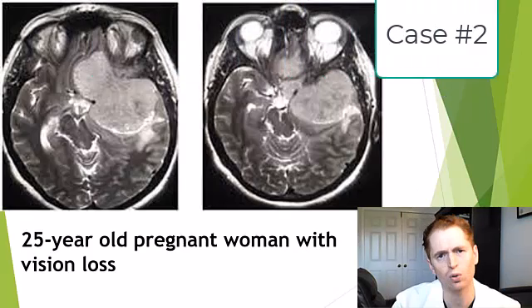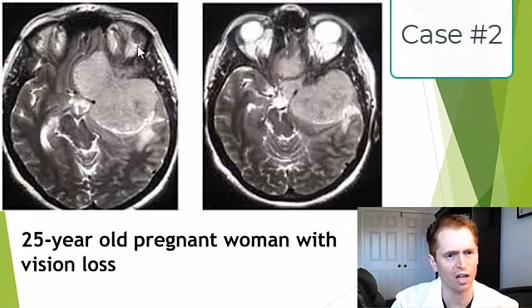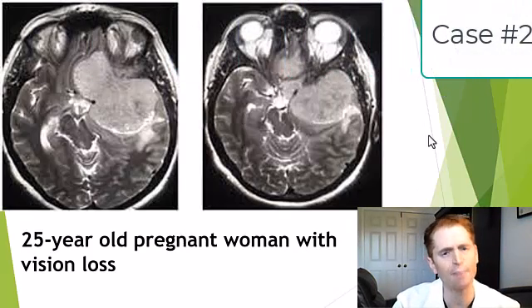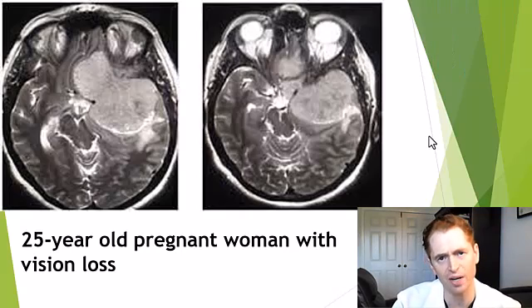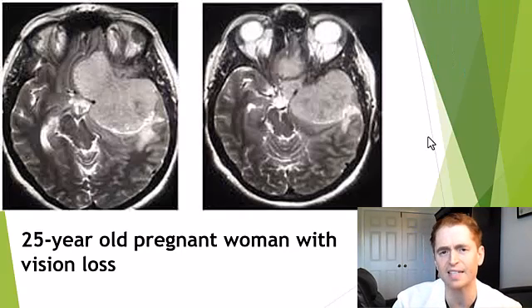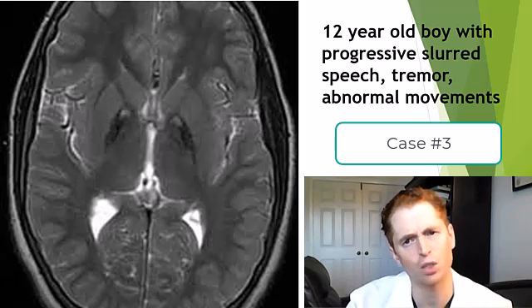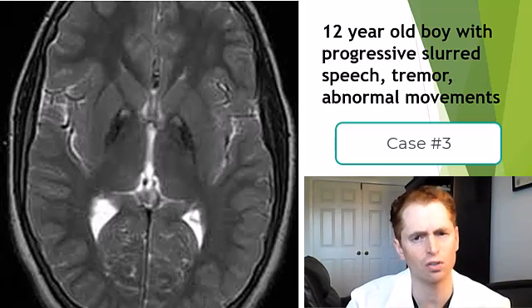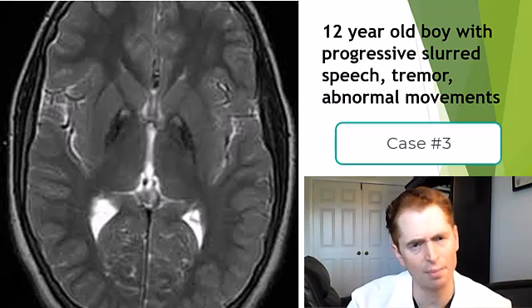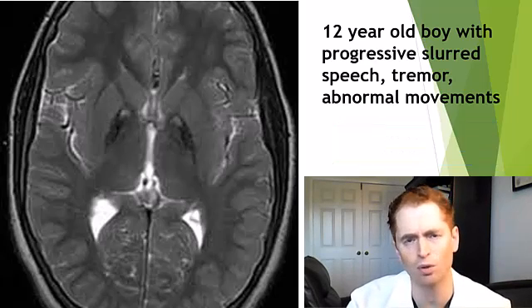We have a 25-year-old woman with vision loss. What is this lesion? Bonus points if you can name the classic exam findings and syndrome which may be occurring. This is the MRI of a 12-year-old boy with progressive slurred speech, tremor, and abnormal movements.